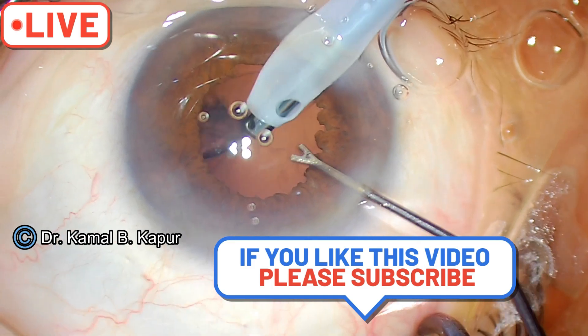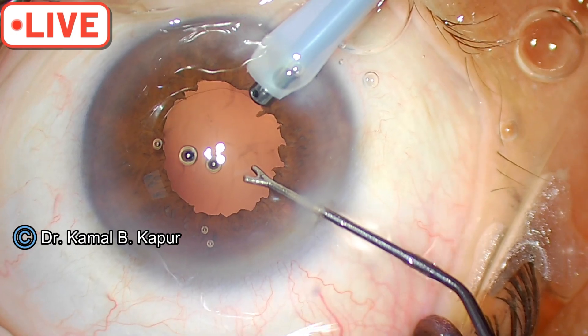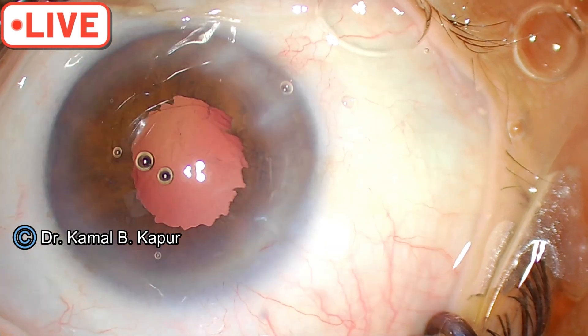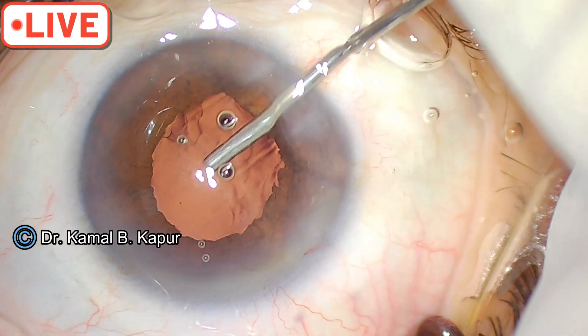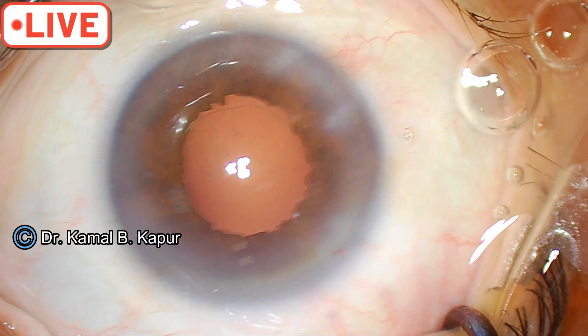You can use bi-manual IA if you are comfortable. I am comfortable with both, so I am choosing to proceed. Put in some viscoelastic, then push in the lens and the surgery is over.